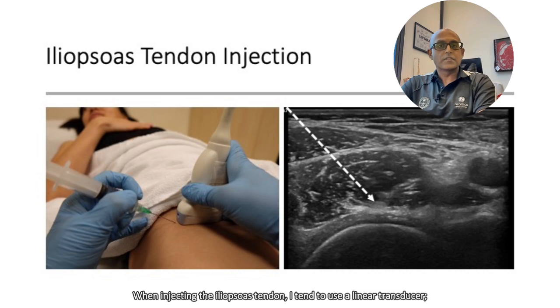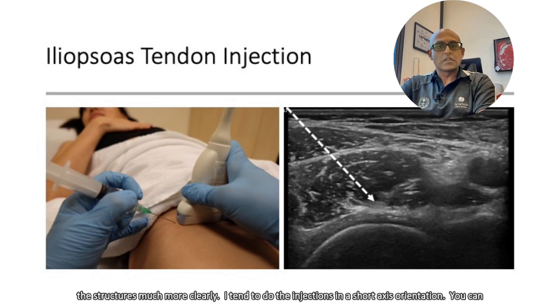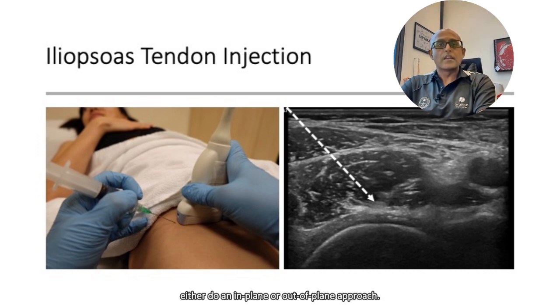When injecting the iliopsoas tendon, I tend to use a linear transducer. Ideally, if you have one that is lower frequency, I would suggest using this because it will allow you to see the structures much more clearly. I tend to do the injections in a short axis orientation. You can do either an in-plane or out-of-plane approach.